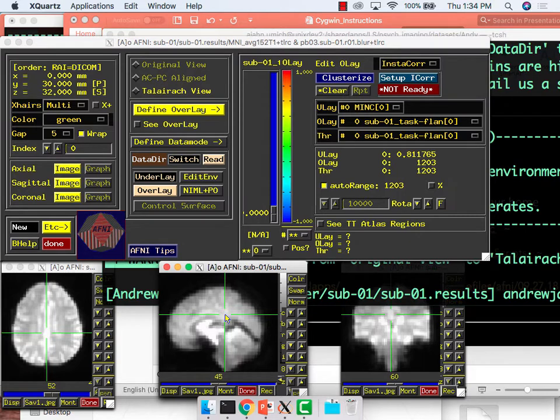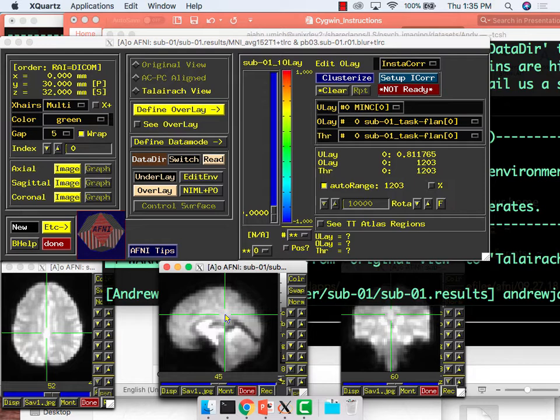So the chain of steps that happens to do normalization is first it takes your anatomical image and it warps that to some template image. Your anatomical image looks the most like this template so it matches that to the template, it sees how much it needs to warp it in each dimension to get it matching that template. And because during our registration step our functional and our anatomical images are in alignment, it takes those same steps that needed to warp it and it applies those to the functionals as well. So the anatomical image is almost like this intermediary helping step to make sure that the functional images and the template are in alignment.